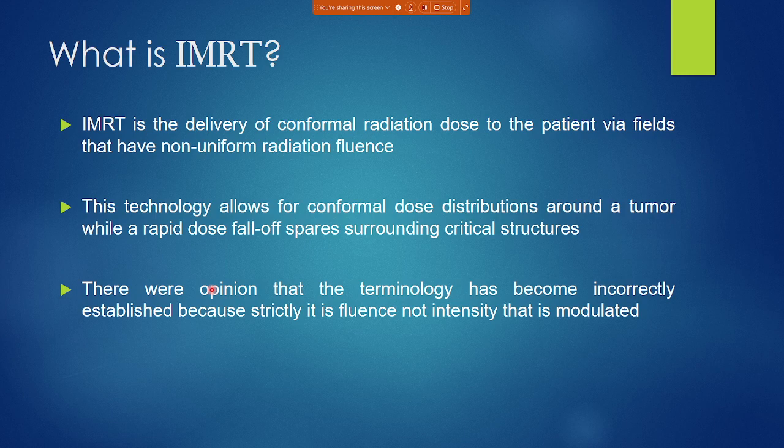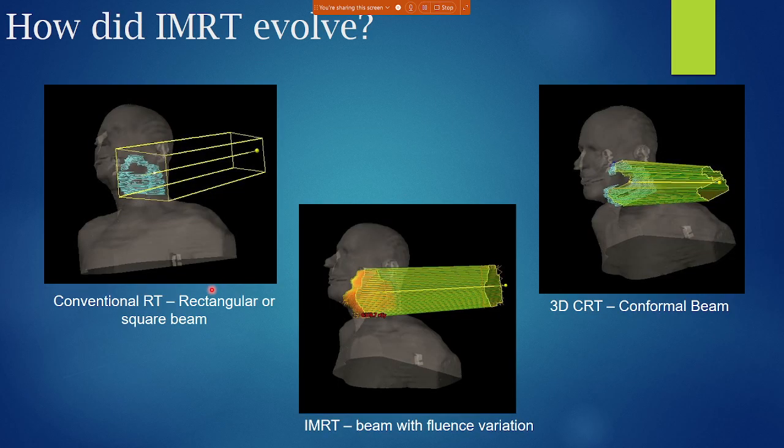There was an opinion that the terminology has been incorrectly established because strictly it is the fluence, not the intensity, that is modulated. However, we have been using intensity modulation forever and it has become the terminology for it.